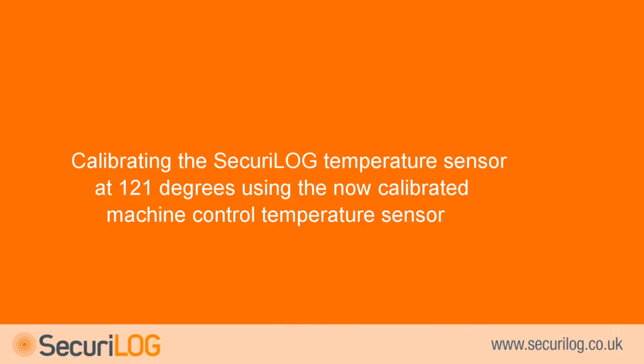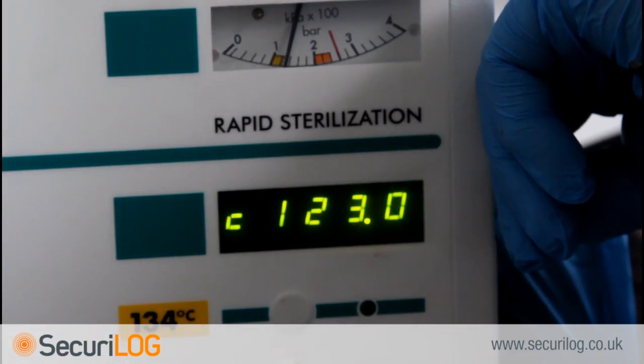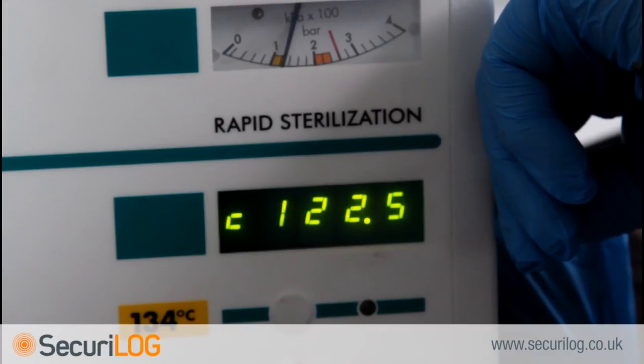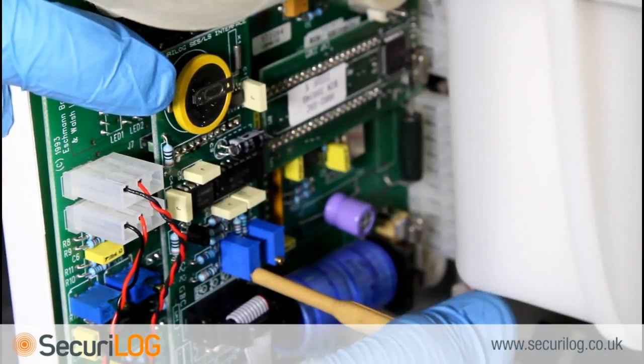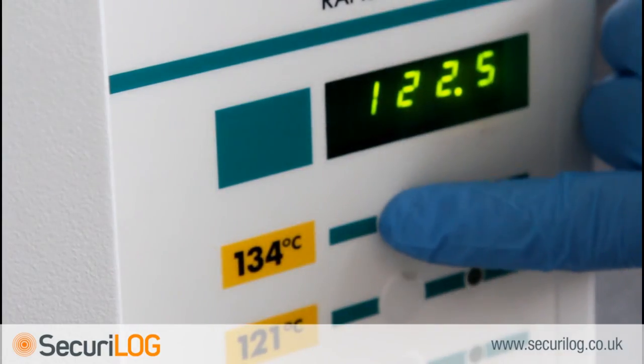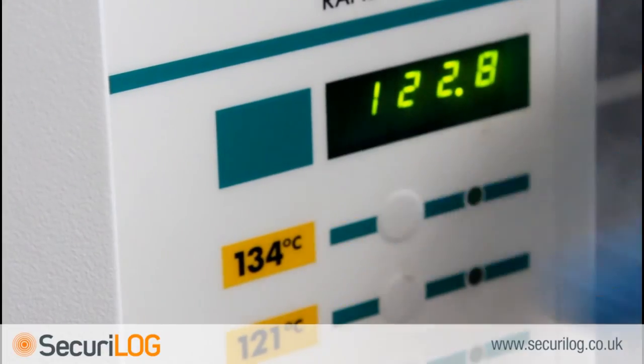Calibrating the Secure log temperature sensor at 121°C using the now calibrated machine control temperature sensor. The Secure log probe can now be calibrated at 121°C using the now calibrated control probe value. Switch between the control and Secure log probe values by pressing button 5. Use the trimming tool to calibrate pot R9 so that the Secure log probe reads the same as the control probe. When the 121°C cycle has been calibrated successfully, press button 1 until a beep is emitted.